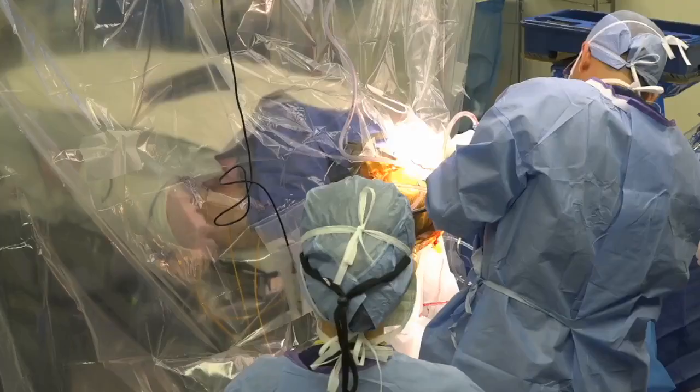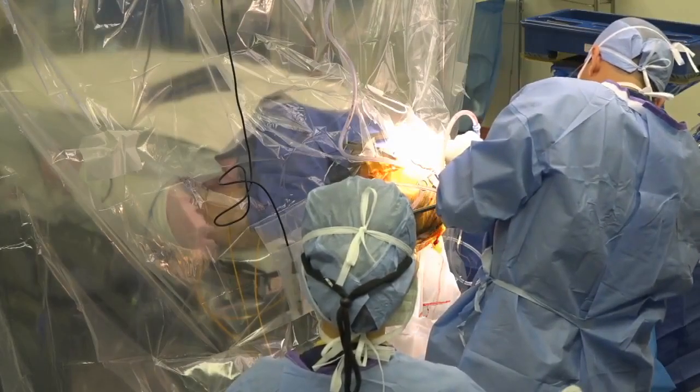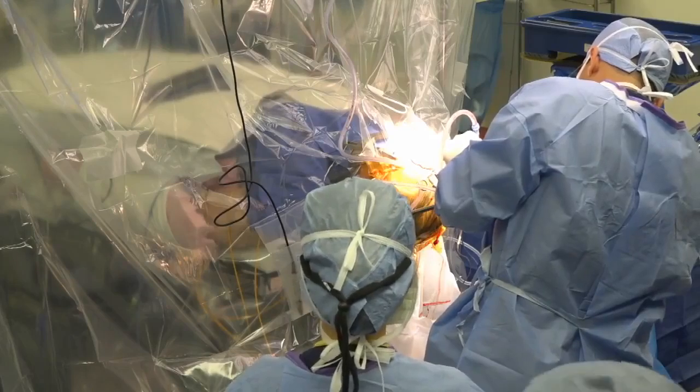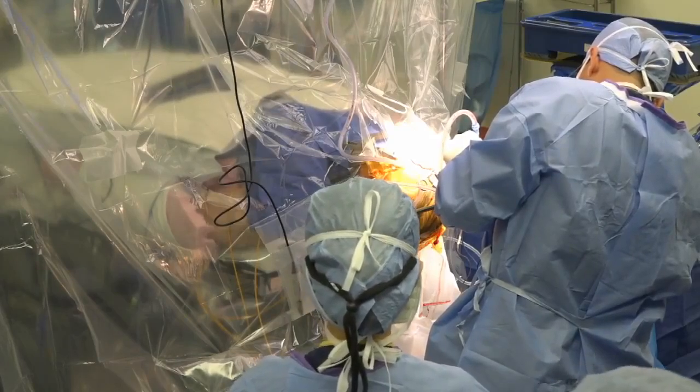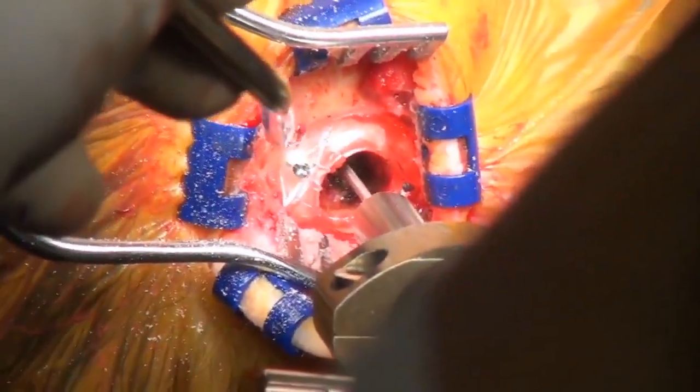So we're trying to get a little window past the dura that's not too wide but not too narrow. We don't want it to deflect our path. That looks good.